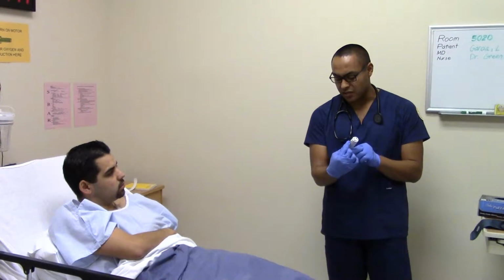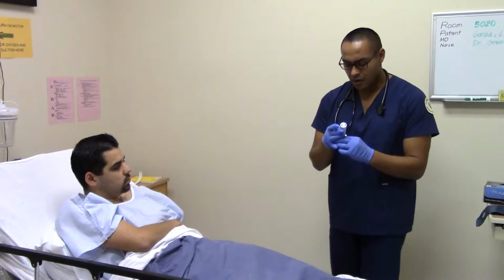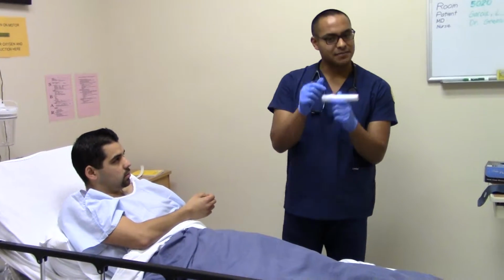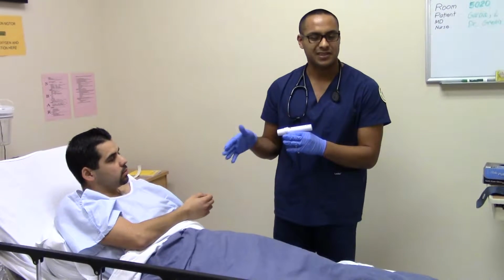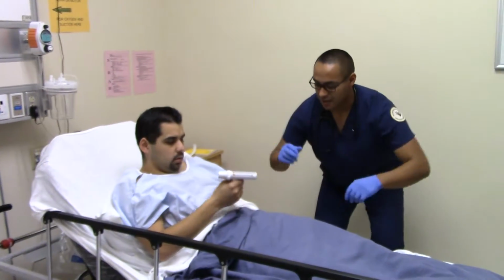Then after treatment, I'm going to do it again. It should be a little bit more. Okay, we'll make sure you get that good. I want to see where you're at. Okay, all right. Go ahead. This is mine. He's not going to breathe it out of it. I'm going to make up a number that's related to his clinical situation. I'm going to take a breath in and then breathe out right through there.